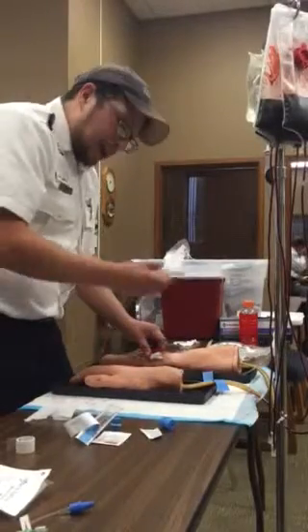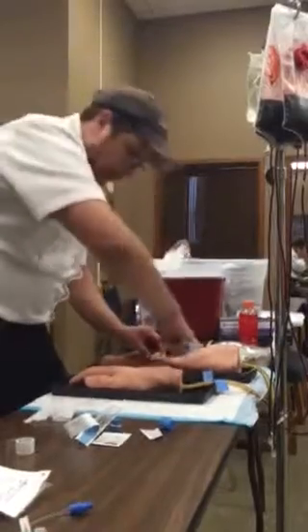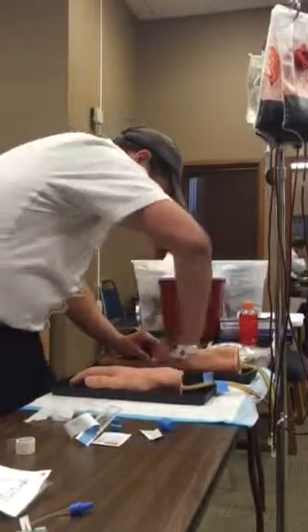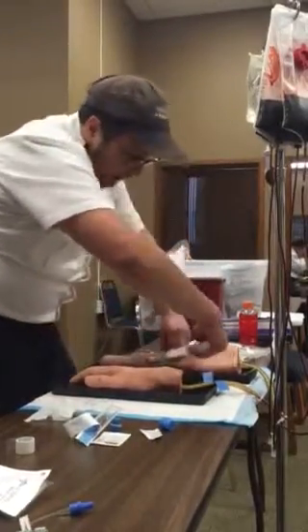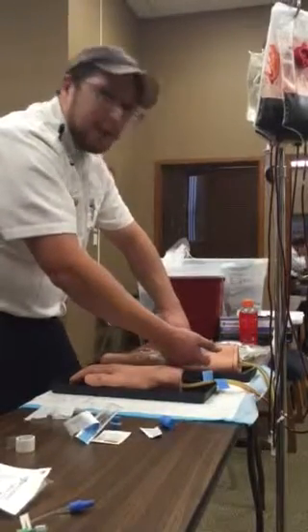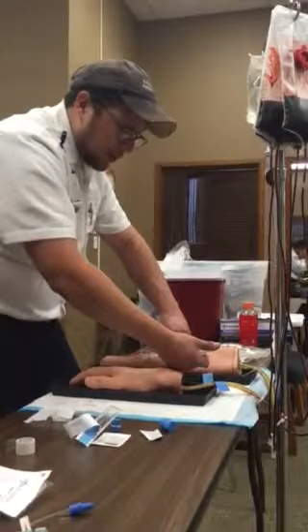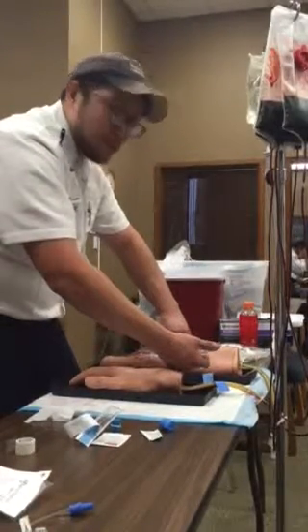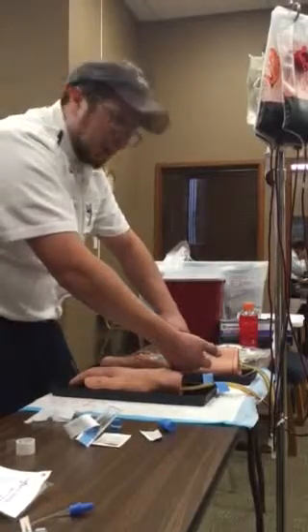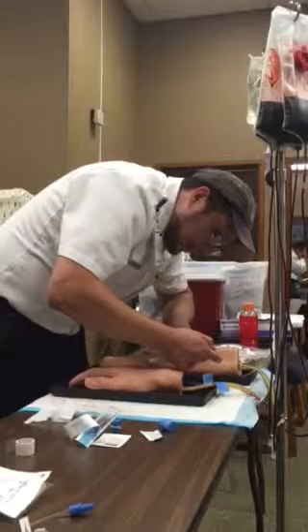Okay, again, I'm going to make sure I'm giving atropine at 0.5 milligrams. I'm going to go ahead and administer my atropine. I'm going to kink my line here. How much of the vial are you administering? Half of the vial, because it's 1 milligram per 10 mils here, or 0.1 milligrams per mil, and there's 10 mils. Alright. So I'm going to give 0.5 milligrams of atropine. Got my line kinked.